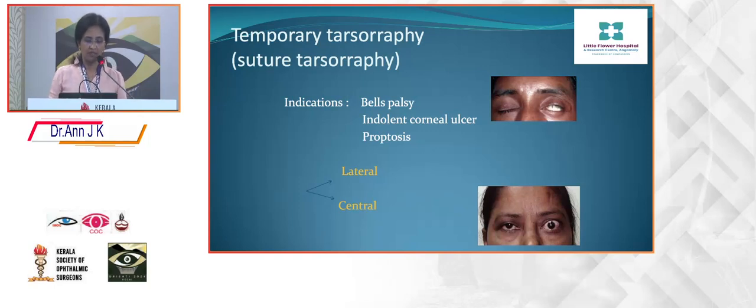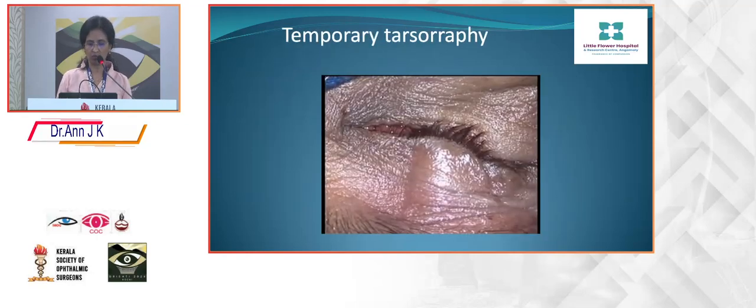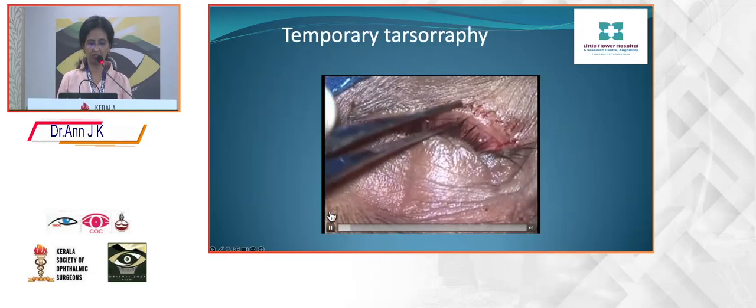It can be lateral, central, or medial also. So this is a short video of temporary tarsorrhaphy.